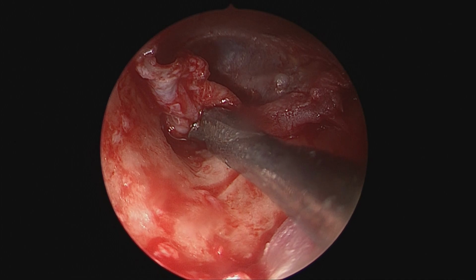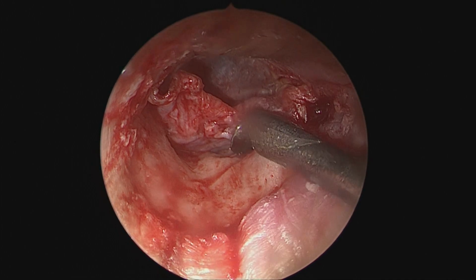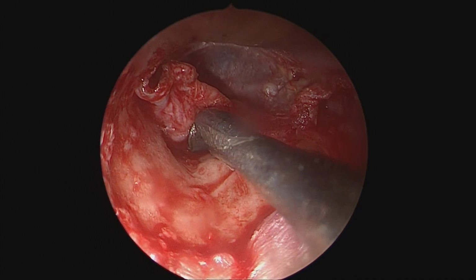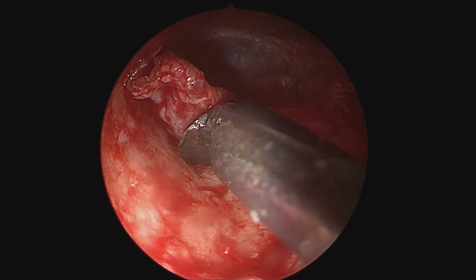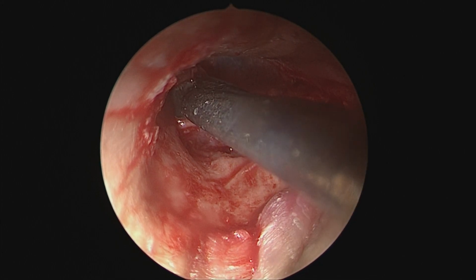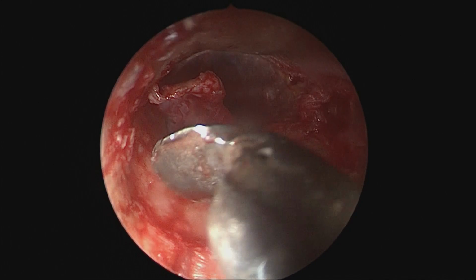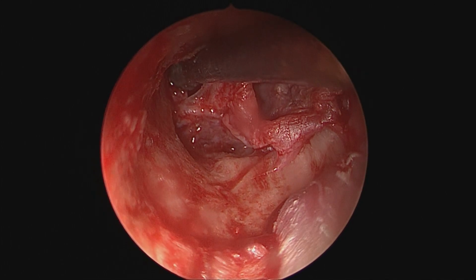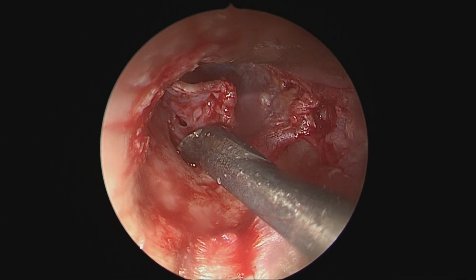One can see now the annulus inferiorly at least. And we go medial to the annulus now to elevate the tympanomeatal flap with just a slight vision of the chorda tympani. So one must take care to elevate the entire flap in toto to avoid flap tears. We can see a small flap tear inferiorly that is lateral to the annulus. Most likely that should sit back on the canal wall nicely in the end.